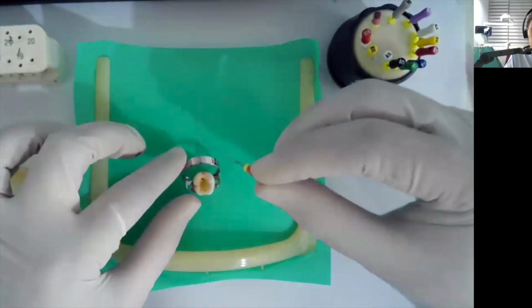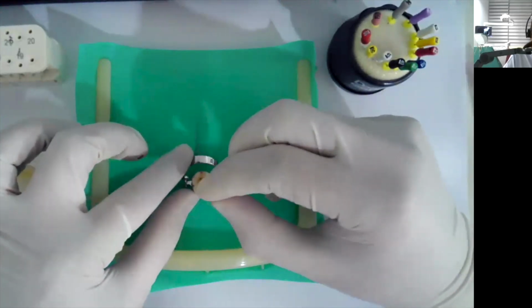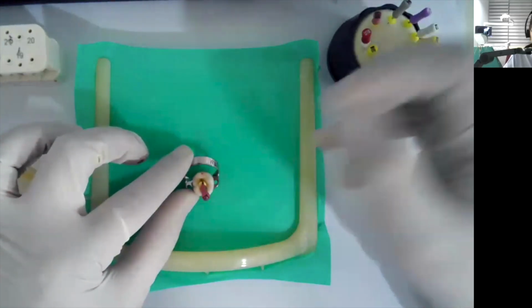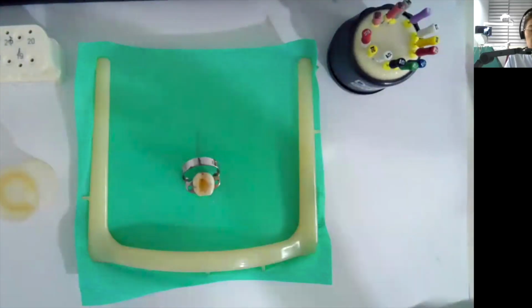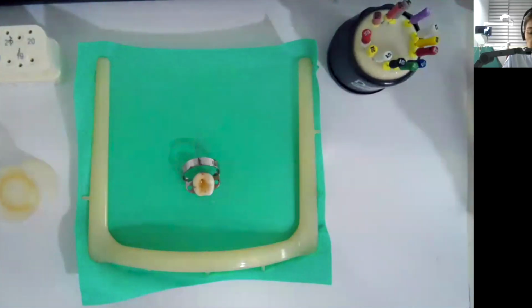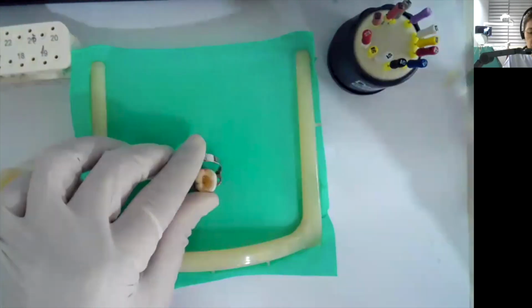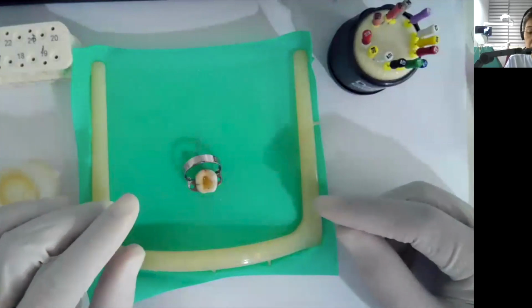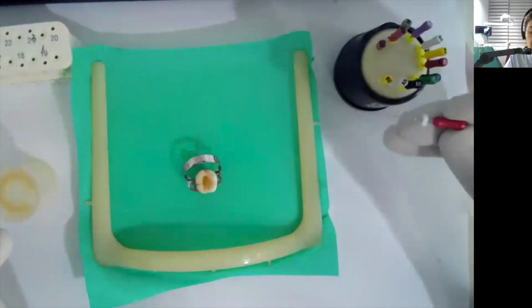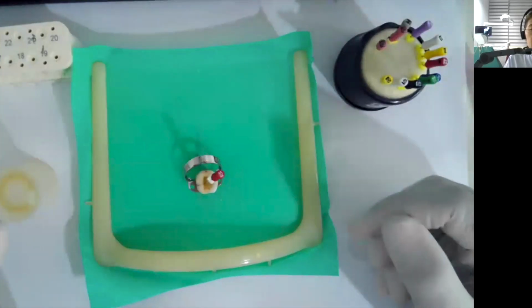I'm going to do the same thing on the distal. I do the watch winding, and now it's reaching the reference point. Since the canals from the cervical and the middle third are very narrow, if I insert size 35, it's 19 millimeters, so it's not reaching the reference point. In doing crown down preparation, I'm also going to use the RT files. So I'll try to use size 55. It's now reaching just the orifice.